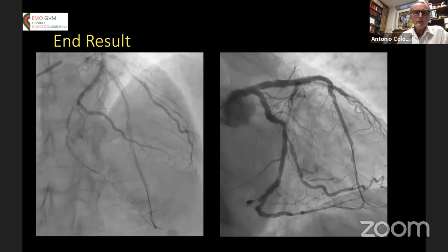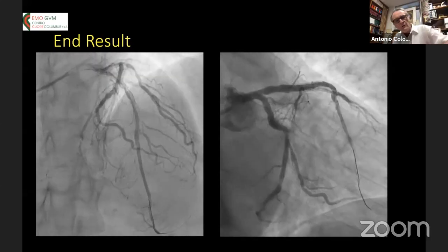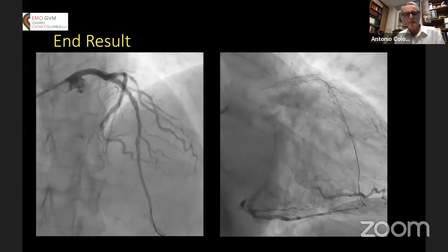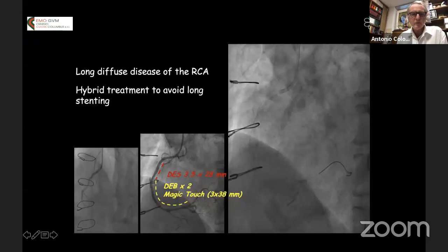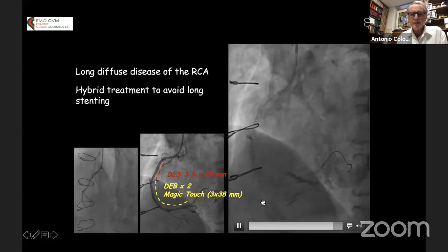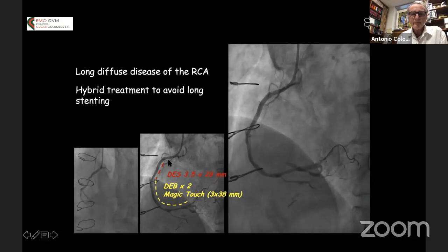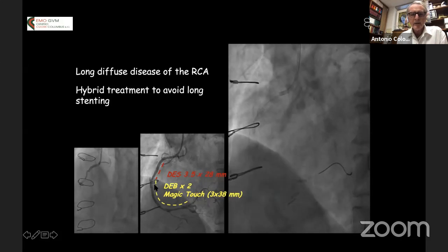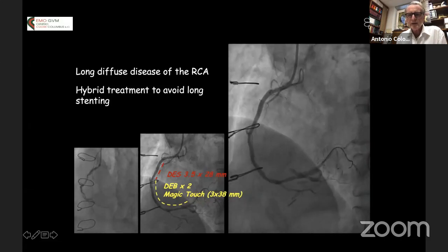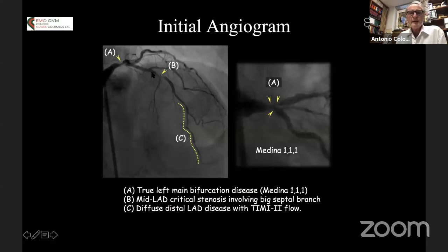We take the drug-eluting balloon as our final treatment. This is our approach: focal stenting proximally with a 24 mm stent, and all the rest is treated with drug-coated balloon. We leave a dissection because we have checked with pressure gradient that the dissection is non-occlusive. Another example: right coronary artery occluded more distally, reopened, good balloon dilatation. Then a DES approximately 3.5×28 mm and a long drug-eluting balloon 3.0×38 mm more distally, with no stent in the other part of the vessel.